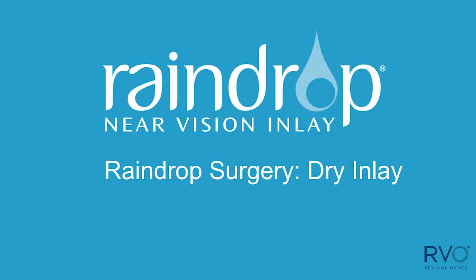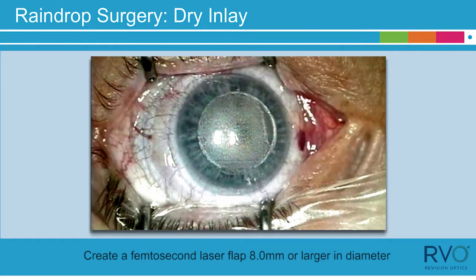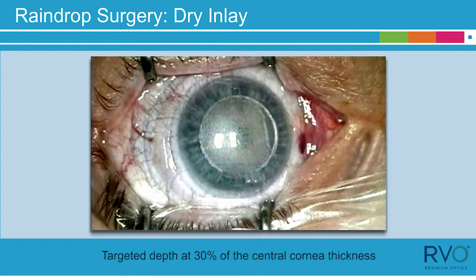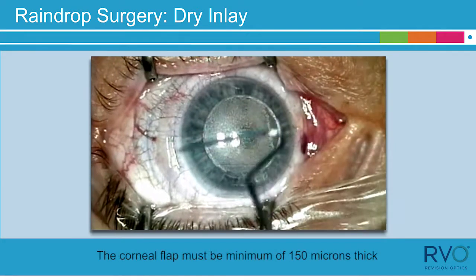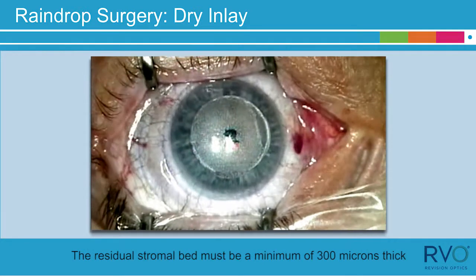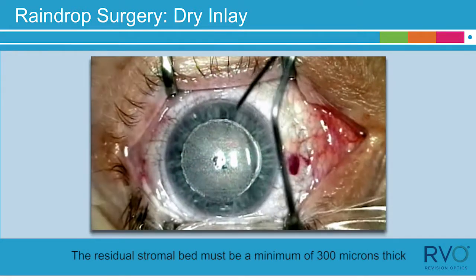Raindrop Surgery Dry Inlay. Create a femtosecond laser flap 8 millimeters or larger in diameter and targeted depth at 30% of the central corneal thickness. The corneal flap must be a minimum of 150 microns thick and the residual stromal bed must be a minimum of 300 microns thick.